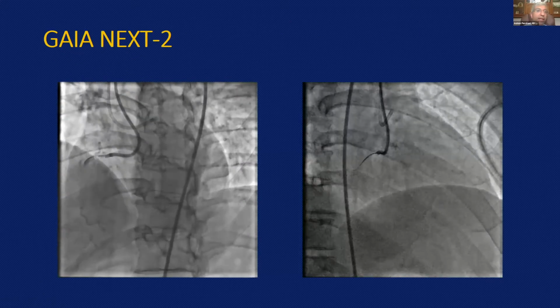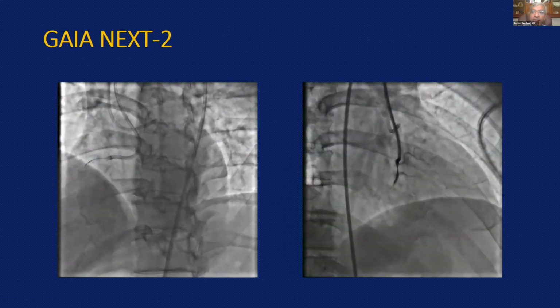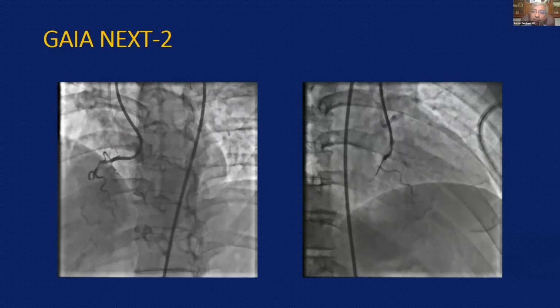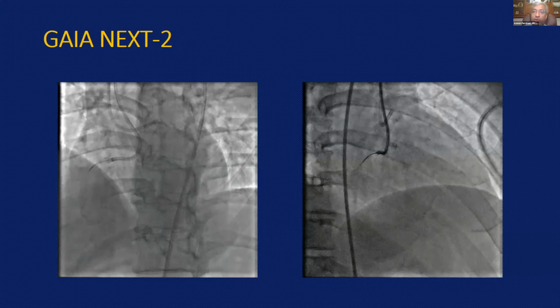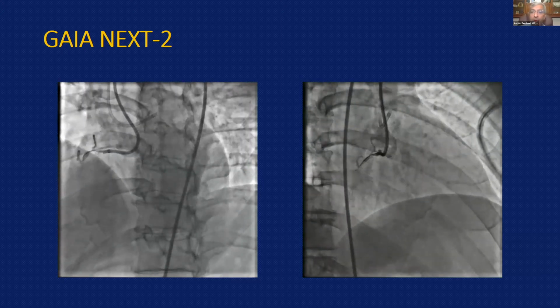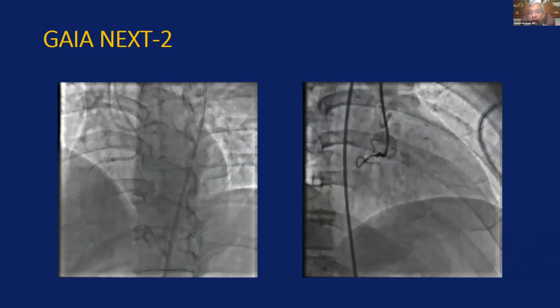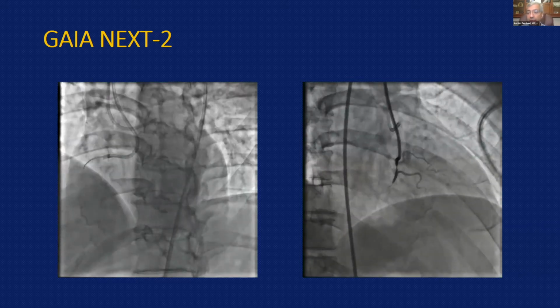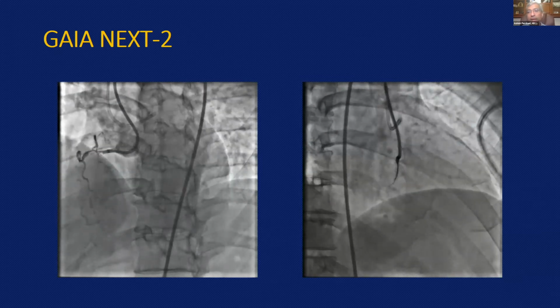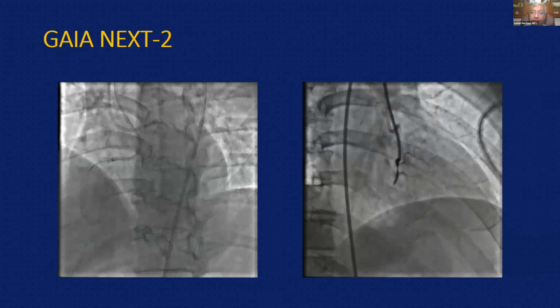So here we are at the proximal cap with a microcatheter, in an RAO projection, and you can tell that you've engaged the cap and you've actually made some progress. In the past, we would use a Pro 12 to do this, and then de-escalate to a Pilot 200 or a Mongo or an XT, knuckle quickly down to the distal cap and re-enter, right? That would be our strategy in the past, and we've done tons and tons of cases like that.